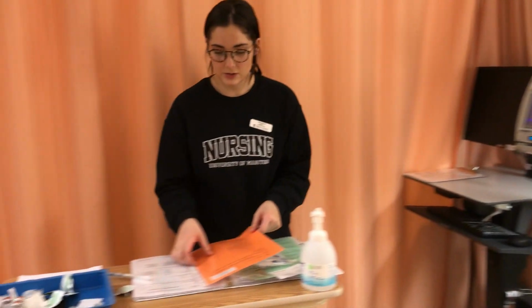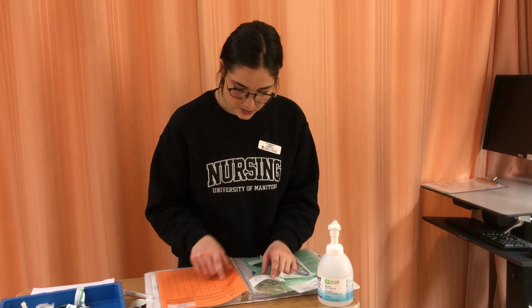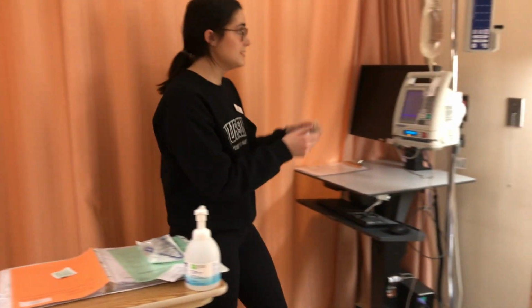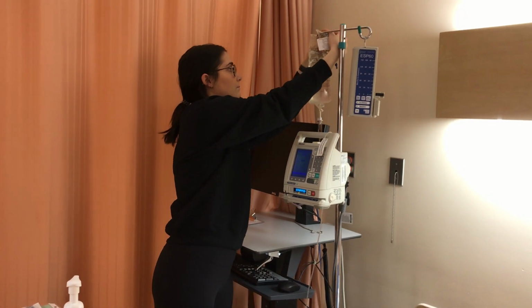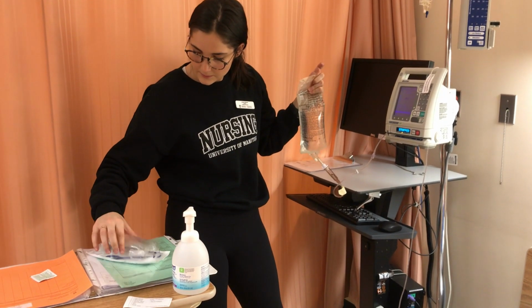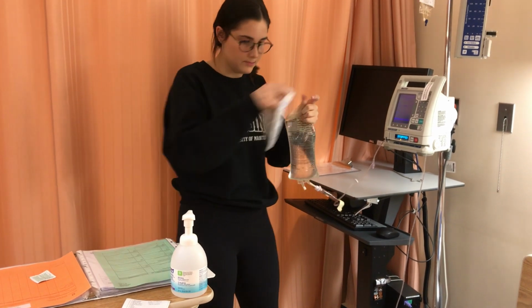Perfect. Okay, so I'm going to do my third check quickly. So we have Penicillin G, 3 million units, and we calculate that to be the correct amount. And it's IV, this is a mini bag, and every 4 hours, and the time is now. Okay, so I'm going to hang my bag, and put my primary line on a hanger.